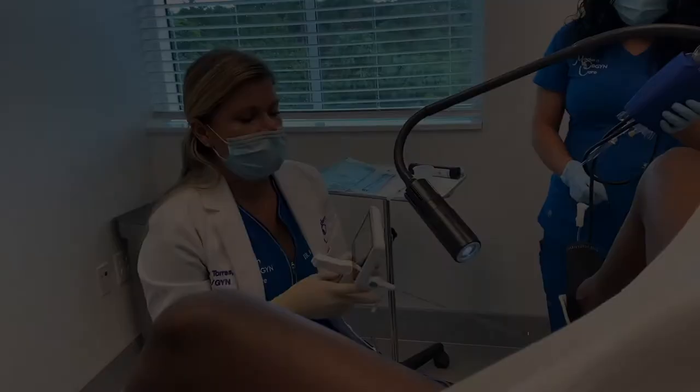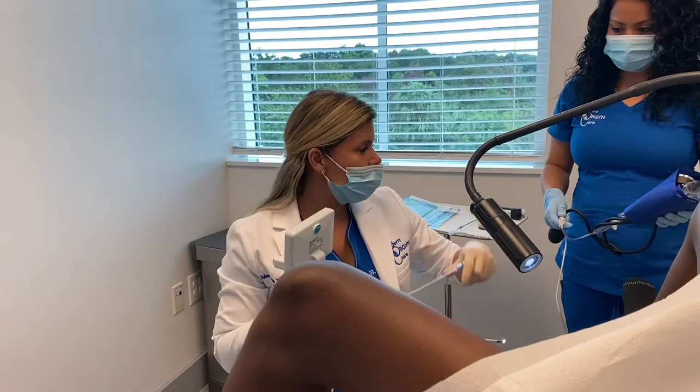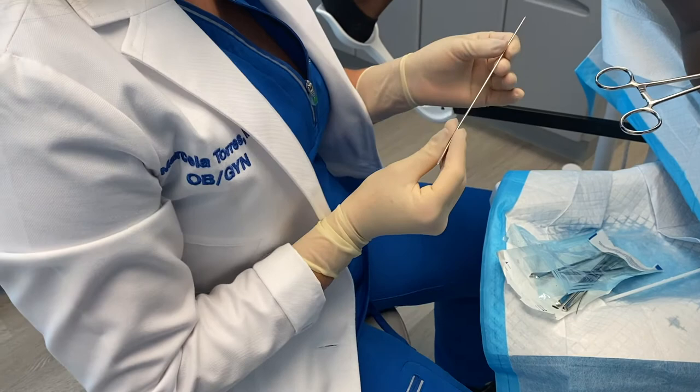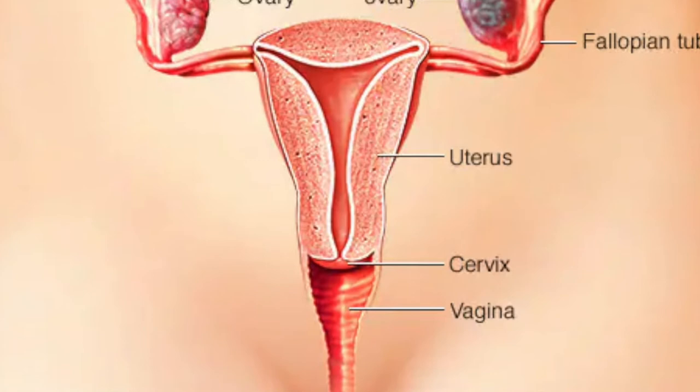So as you can tell, I have a camera here that is gonna visualize everything that goes through. And my nurse has normal saline, which is fluid, that will go through the device. So we're gonna have to do a little bit of dilation because it's very close. So what we're gonna do is use one of these little Hegar dilators that are gonna help us dilate that cervix. The cervix is the neck of the uterus, which is the womb. So it's what gets dilated for a baby.